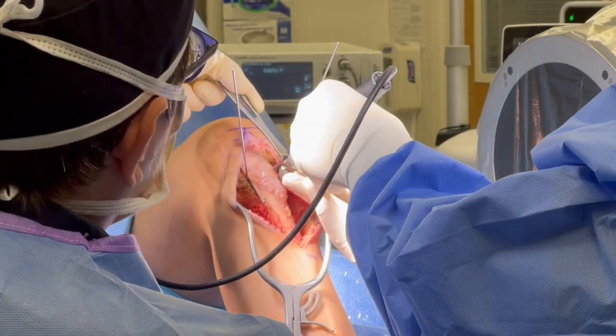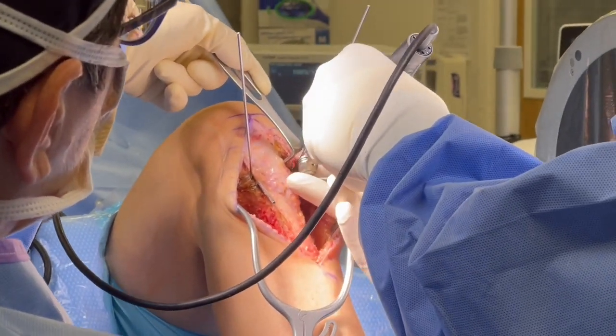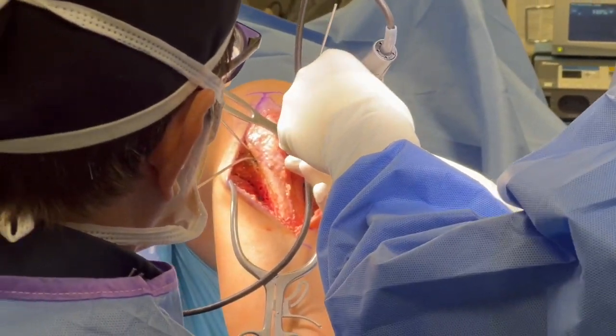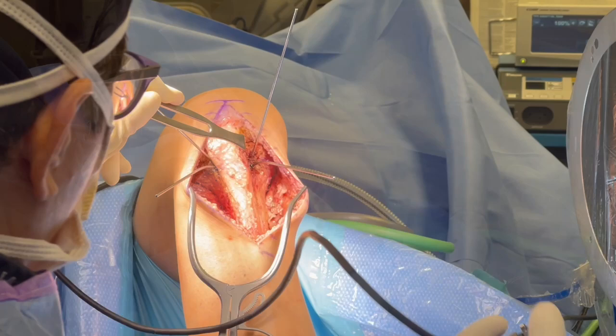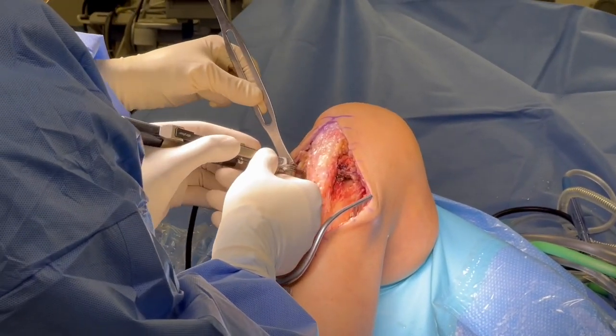You can see here we placed four pins. We bent them out of the way. This is a supra-tubercle approach. We're going to stay right near the edge of the tubercle, going above and below on fluoroscopy, watching on x-ray the entire time as we're going towards the back of the knee. We're going to use the TPS saw on all four levels.